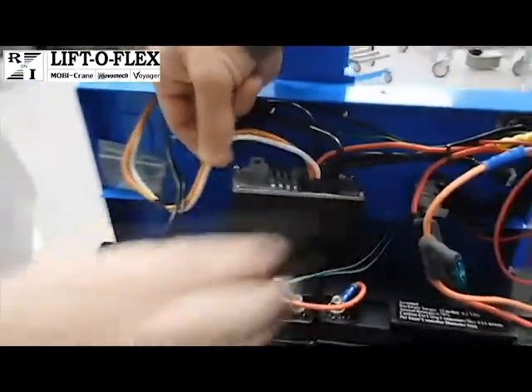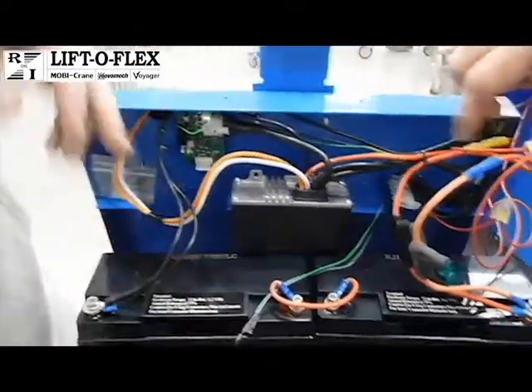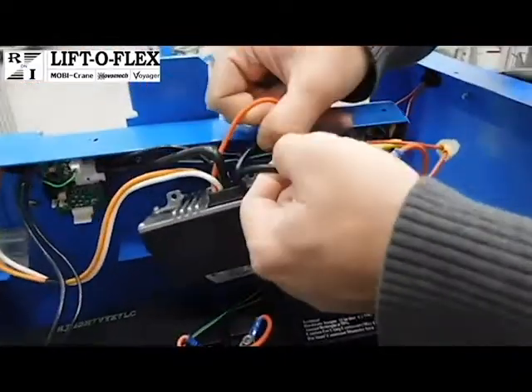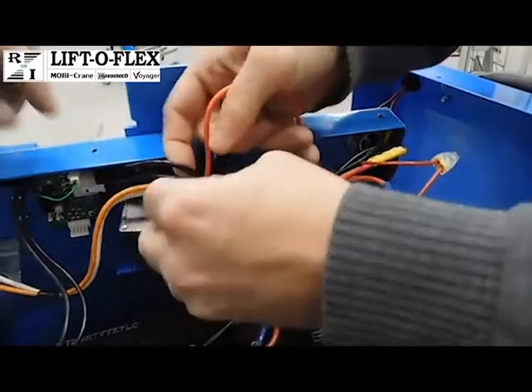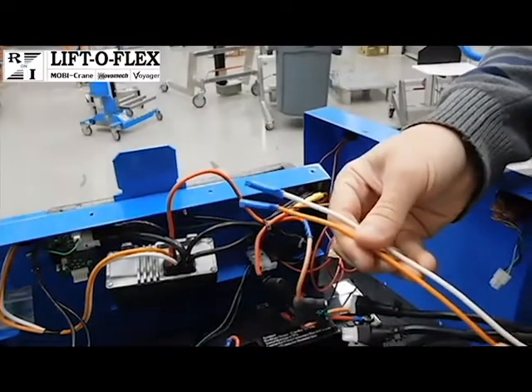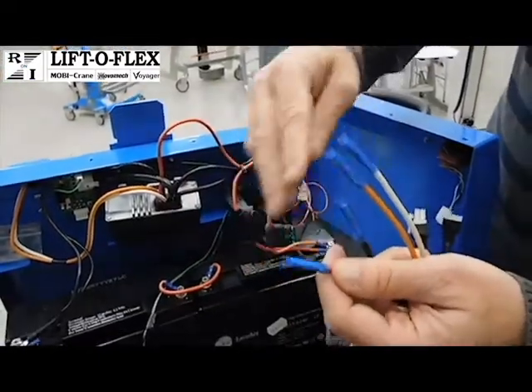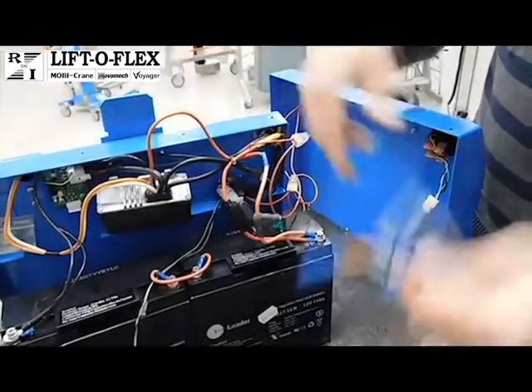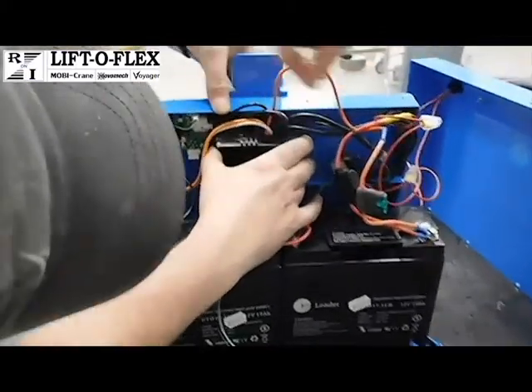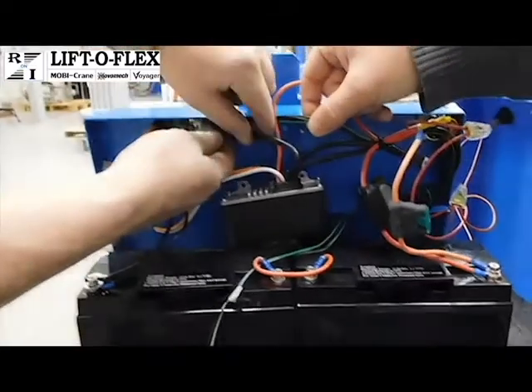At that point, you would have to cut the red wire and the white wire on this side, and the 2 output wires here, which are the red and the black wire, and those would correspond to the wires on the controller. After that's done, you would put the splice joints in, crimp them, and then the new card would be ready to be replaced. Again, you need to make sure all the wires are clear and not pinched underneath. There's a couple wire sets that run behind the card.